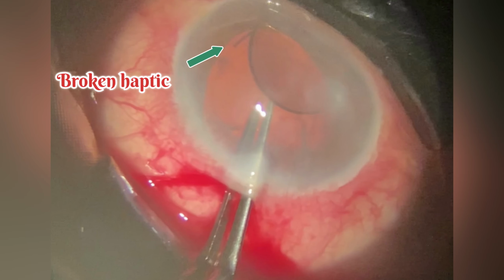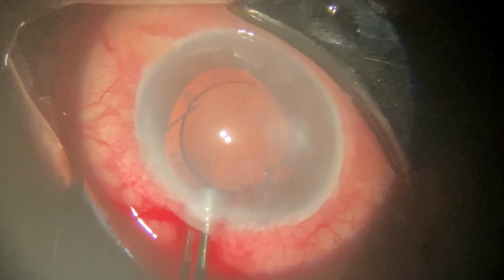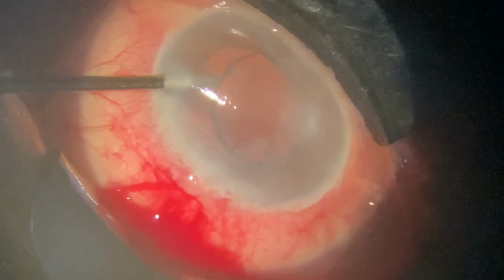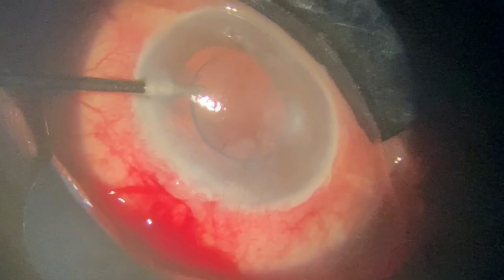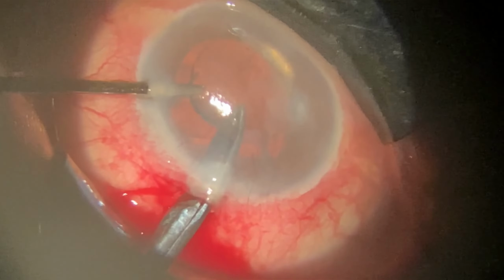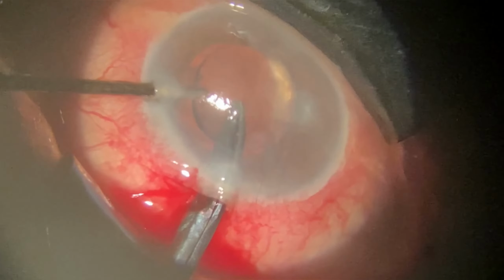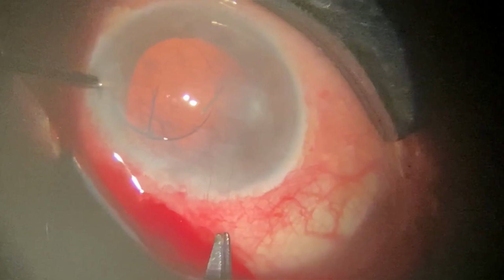This is the broken haptic, and this is the cause for dislocation of the intraocular lens. I am holding the intraocular lens with the micro forceps in my left hand and cutting it through the main port using a curved scissor. I am giving this first incision and taking it to the center of the IOL.